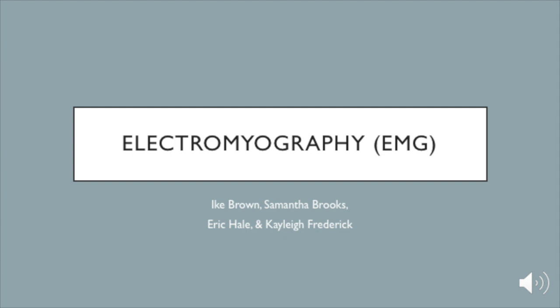Today we are going to talk about electromyography, specifically how to use the DELSYS EMG system through the Vicon Motion Capture System.